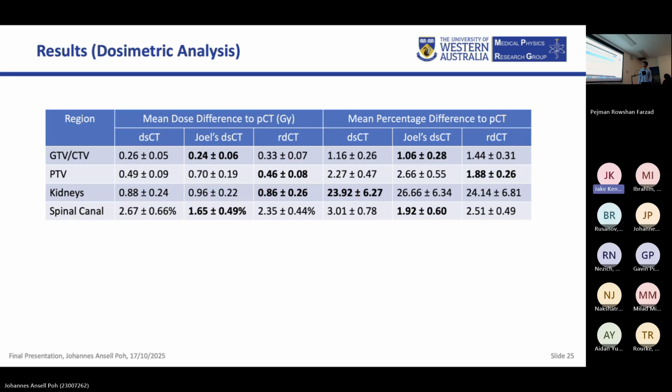The dose differences in this section don't really show that my model outperforms the diagnostic CT. It looks like all those 3 CT scans have similar performances.